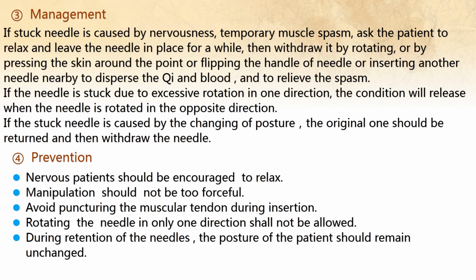If the needle is stuck due to excessive rotating in one direction, the condition will release when the needle is rotated in the opposite direction. If the stuck needle is caught by the change of posture, the original one should be returned and then withdraw the needle.